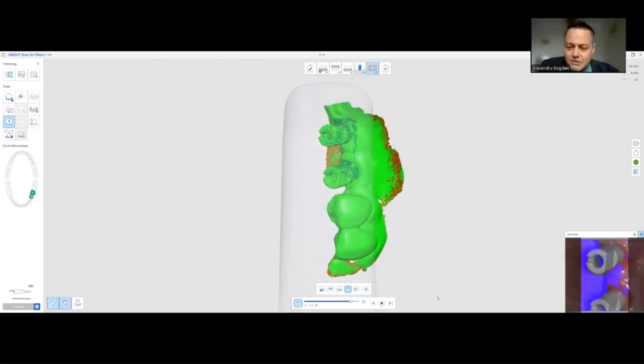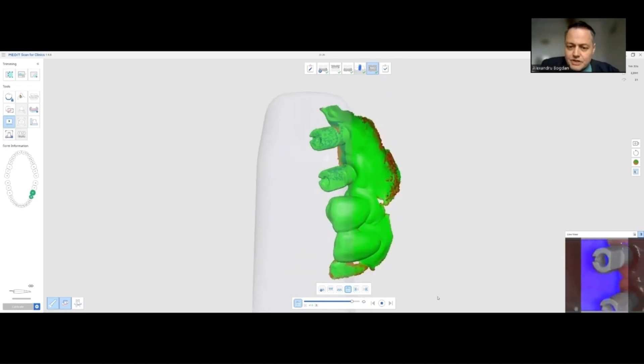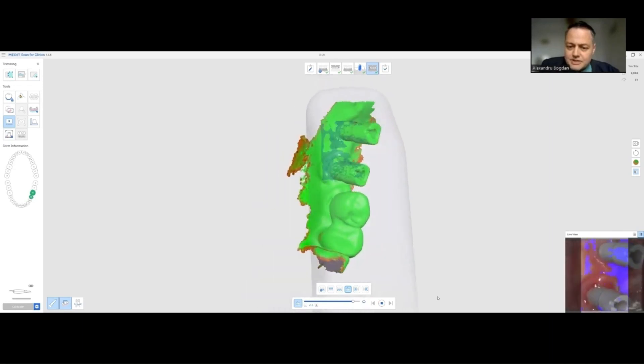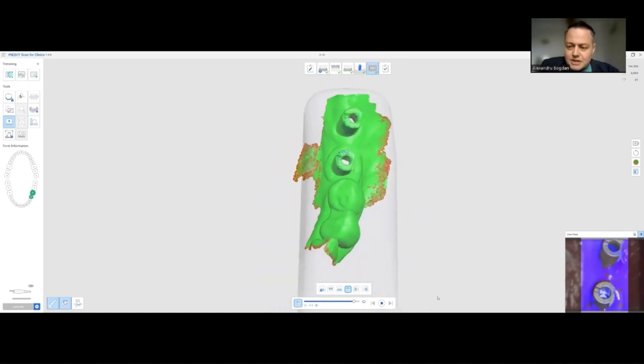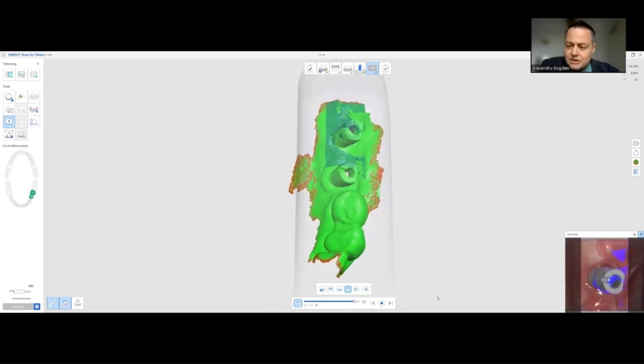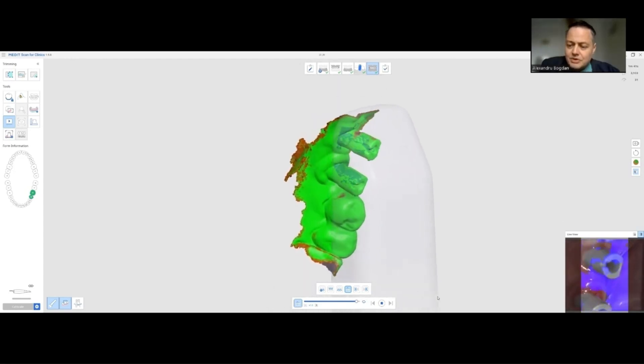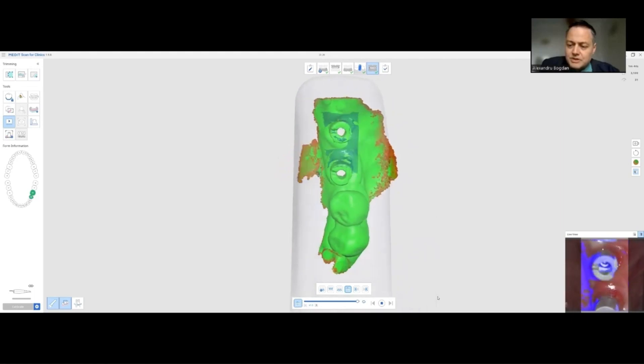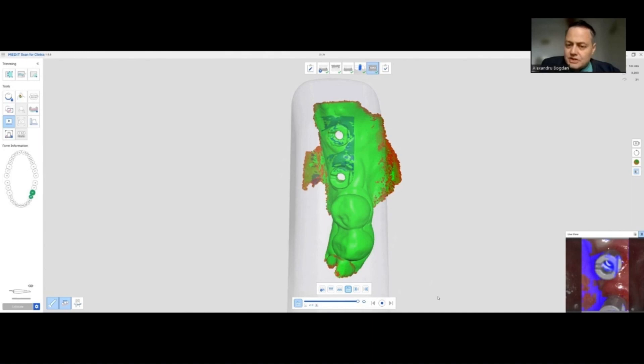You will see this now. We already have the distal part of our first scan body and now we're going to start and add some data to the second one. I am trying to keep contact with the teeth, this is not always possible but it's the best way to do it. And when imaging the second scan body, I always try to have some information from the first one so that it can be a better scan.